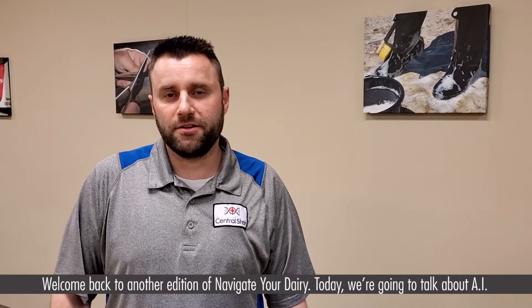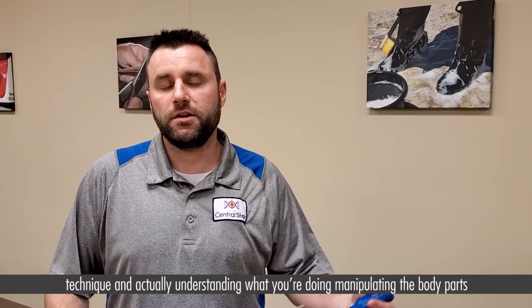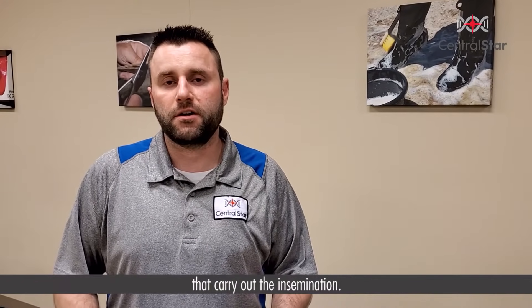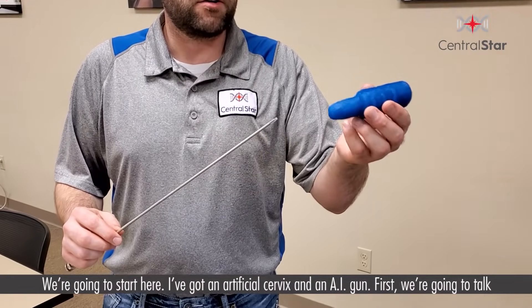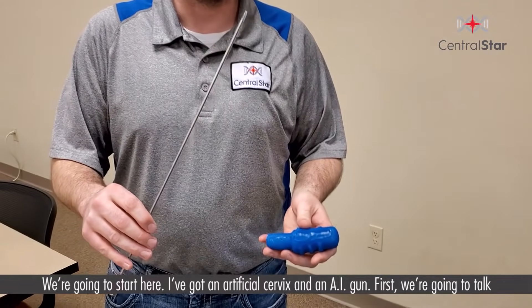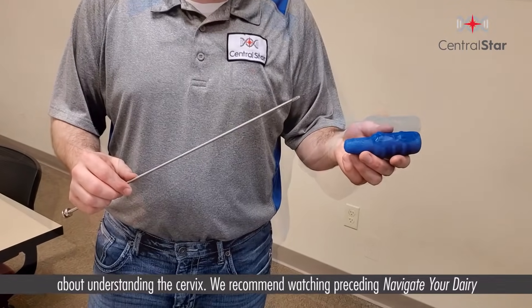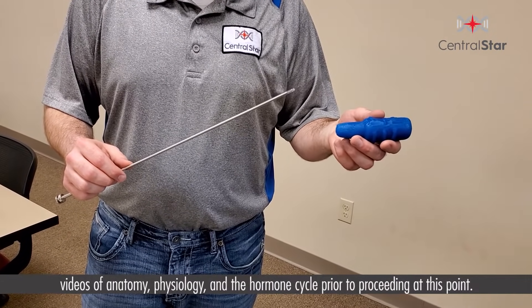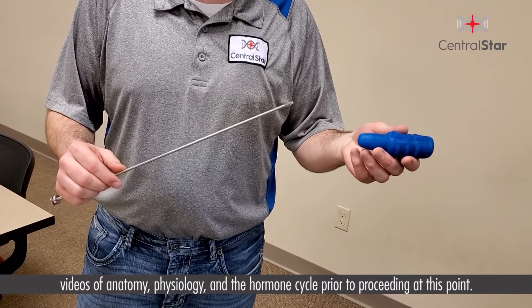Welcome back to another edition of Navigate Your Dairy. Today we're going to talk about AI technique — actually understanding what you're doing, manipulating the body parts, and carrying out the insemination. We're going to start here with an artificial cervix and an AI gun. First we're going to talk about understanding the cervix. We recommend watching preceding videos on anatomy, physiology, and hormone cycles prior to proceeding.